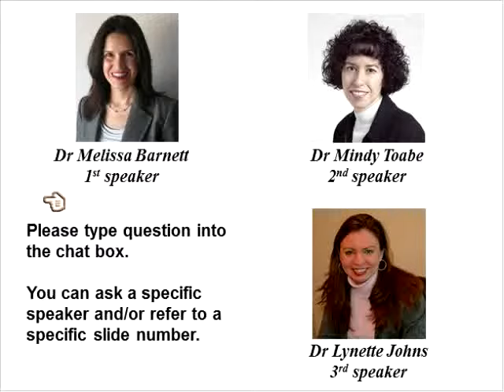When we find wetting defects in our office, sometimes we just wash the lens again with ESC cleaner or Boston laboratory cleaner. We do avoid the Boston abrasive cleaners because we don't want to eliminate the plasma treatment to the surface, and those tend to be a little more abrasive. And then sometimes we use Boston original conditioner, but sometimes cleaning it is enough if it's well plasma treated. I hope that answers your question.